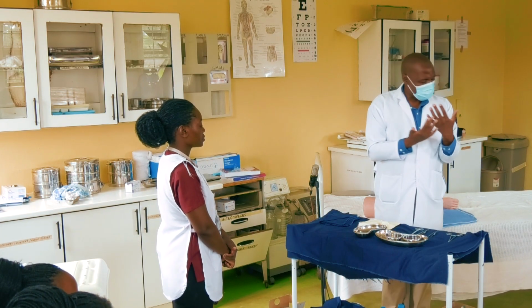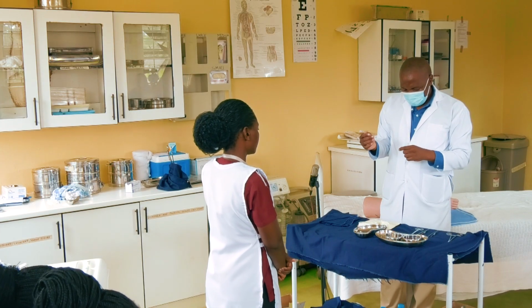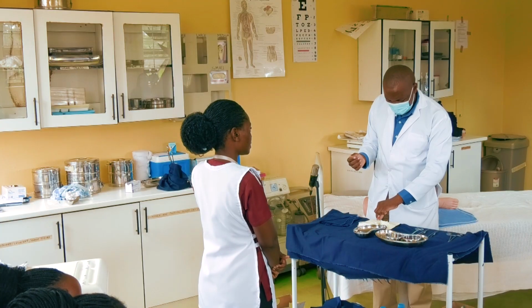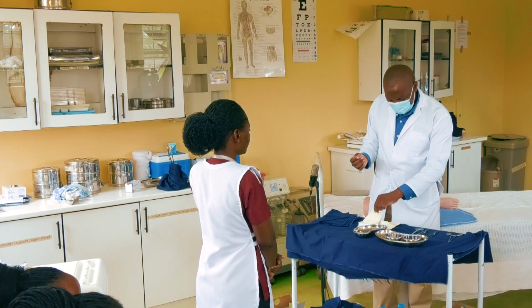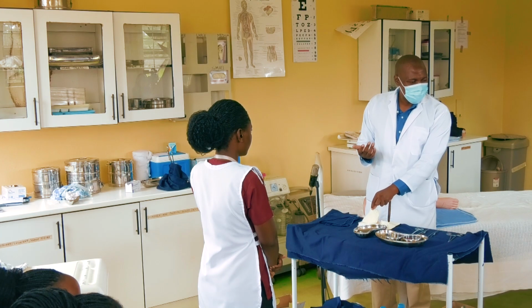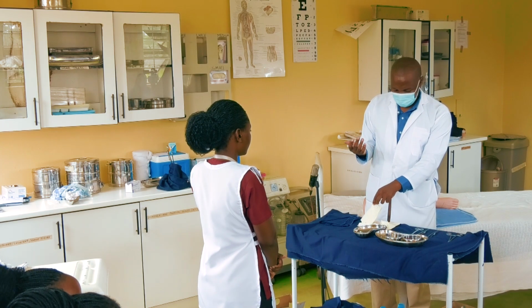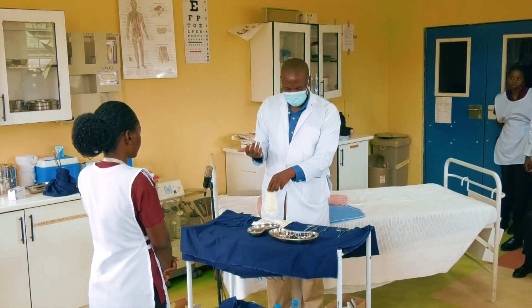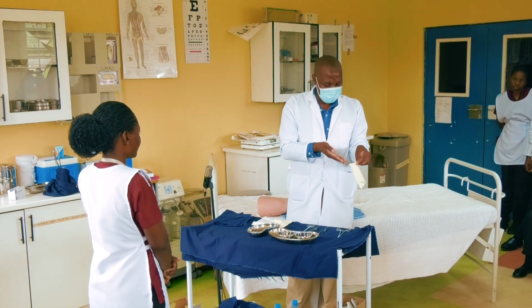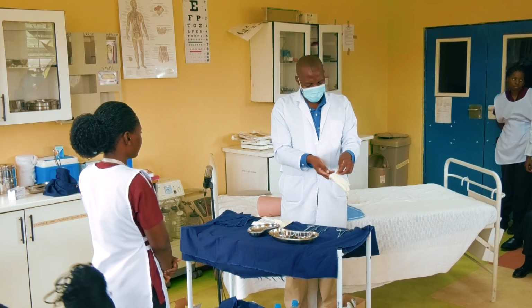Gloving, we know the types of gloving. What's the first one? Open method. Open method is the one that I'm going to use. The second one? The third one? You will not go to theater like that. The third one is what? Plunging method. Okay, so this is the right one, right?